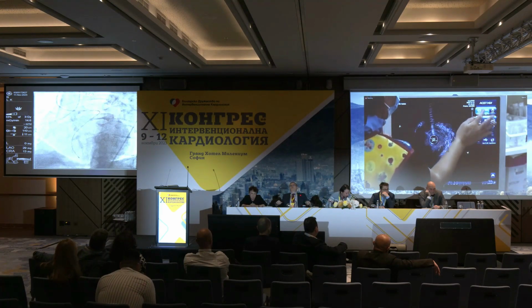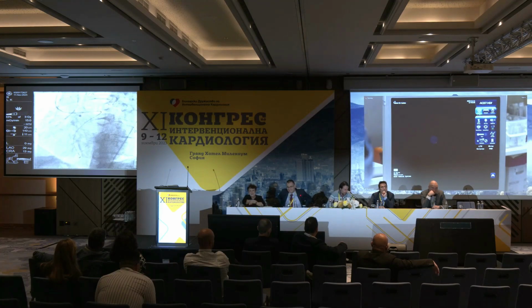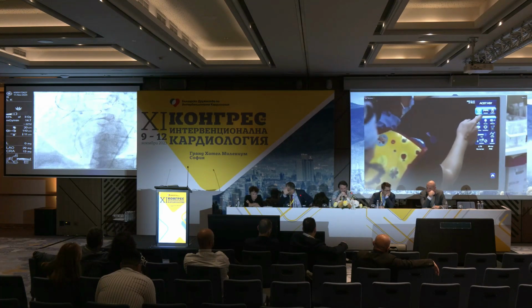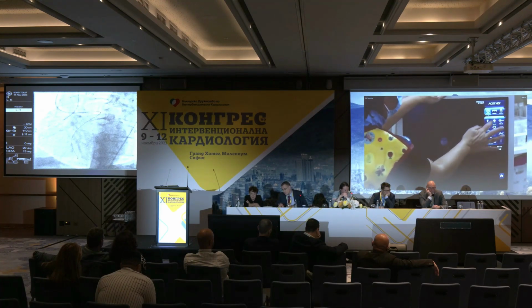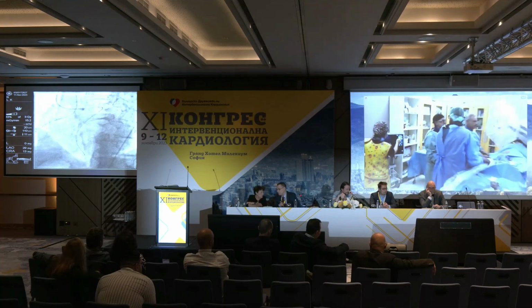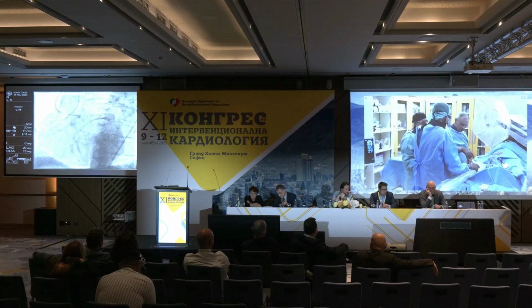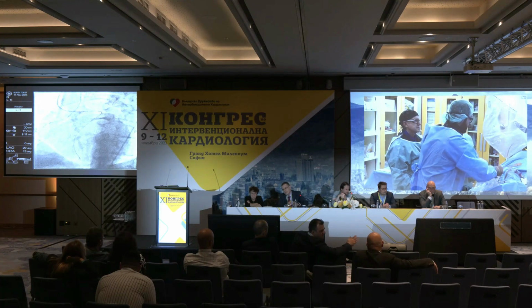Okay. Flush a little bit, please. So what kind of IVUS is this? Is this still the assist? It's assist. Okay. This is the assist, yes. Can we get a little bit more image, Dr. Jeleva? I don't know why I lost the image there. The guiding is still in. We got the ostium for a certain period of time. Give me a little bit of contrast from the right side just to see where the guiding is sitting. Let's make a film also.